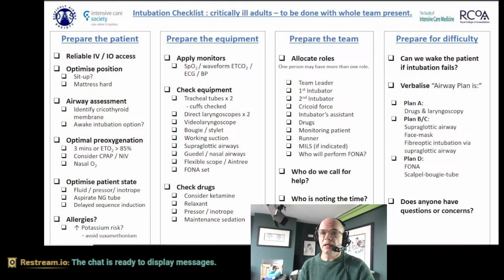And the other important thing is that once they're off to sleep, you need to keep them asleep. So just remember that you're going to have to get an infusion, a 50 ml syringe full of whichever drug you've decided to keep them asleep with. So again, propofol or ketamine, probably the most common ones. So if you have that ready, and you can even have it attached to one of their Venflons before you start, and then once the patient's actually intubated, you can just start that infusion straight away.